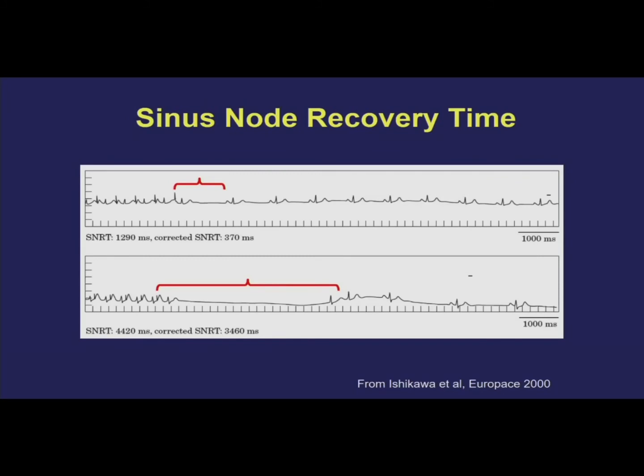It's a little bit moot. If you can take a recording that someone fainted when they had a long sinus pause, you could reprove it again in the EP lab, or you could go ahead and put in the pacemaker because you've recorded simultaneously the problem with their symptoms.